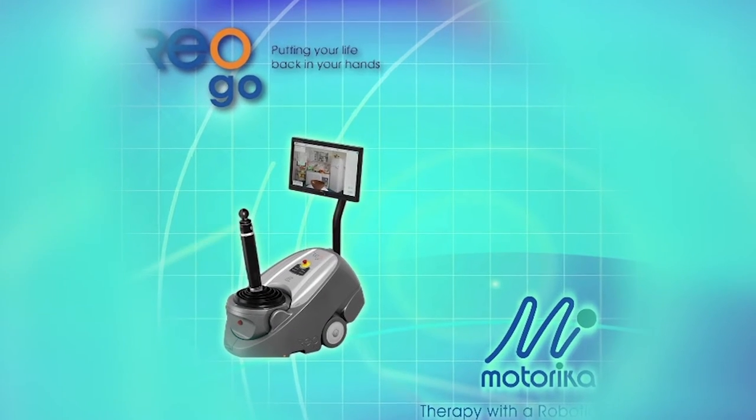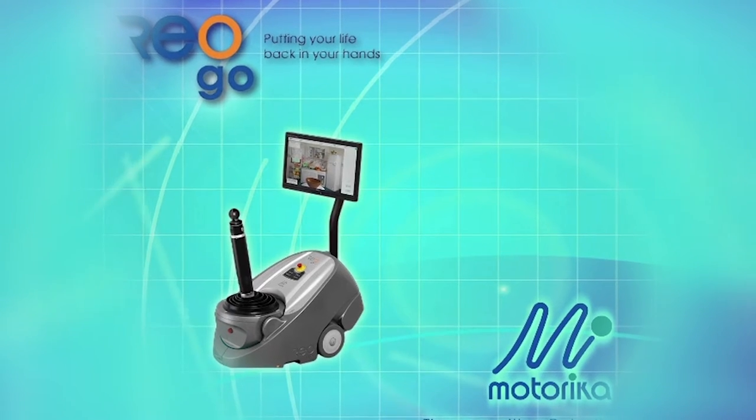Congratulations on the purchase of your REOGO. We at Motorika are very excited to start teaching you how to use your REO. The REO is an advanced robotic device designed to help promote neuroplasticity in patients who have lost some or all of function in their upper extremity.